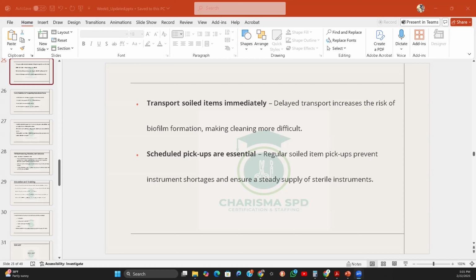But if you just brought it and then you offloaded the dirty instruments and you wheel it to the clean side to transport instruments back to the OR, it is a red flag, it is a no-no. So the only condition under which the same cart that transported dirty instruments from the OR can carry clean instruments is only when it has been decontaminated. Does that make sense?